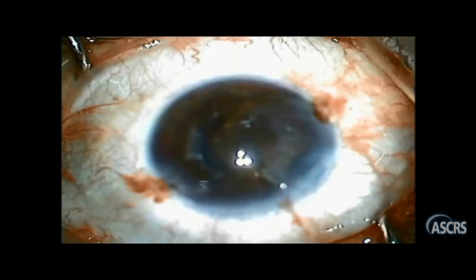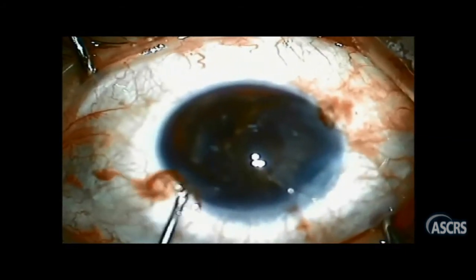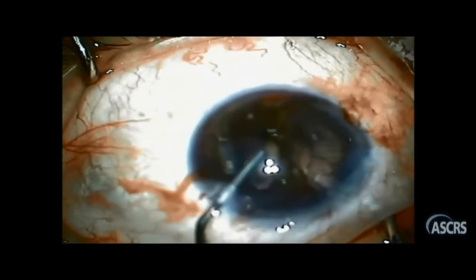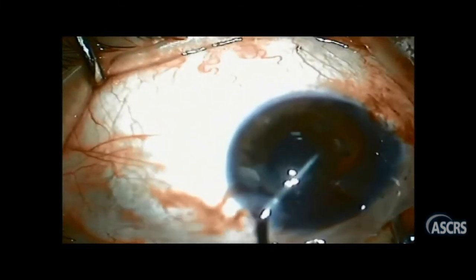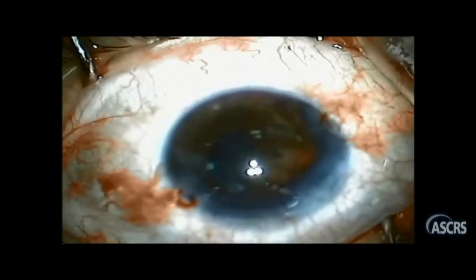She called for my help. I scrubbed in as fast as I could, and to be honest, for a few moments after I sat down on the microscope, I was in a shock stage — total flaccidity of thinking. What on earth should I do now? I took a deep breath, thinking for a while, injecting some viscoelastic, trying to explore how big the problem was that I had to solve, trying to set up my mind and put a plan.